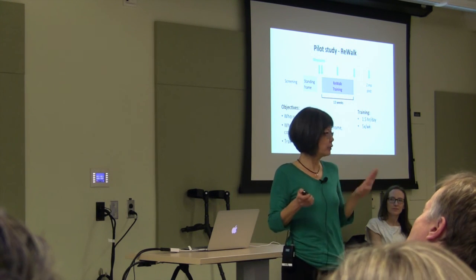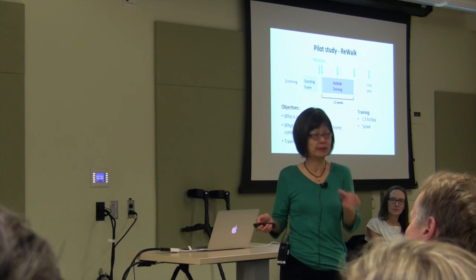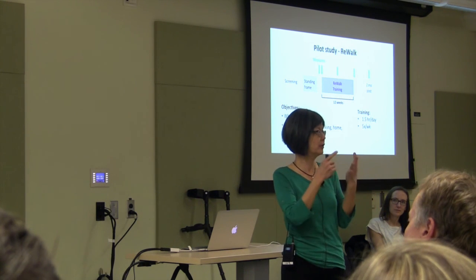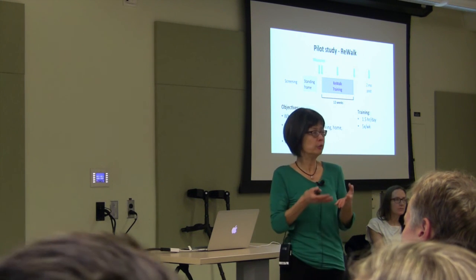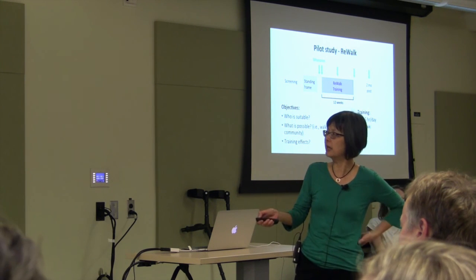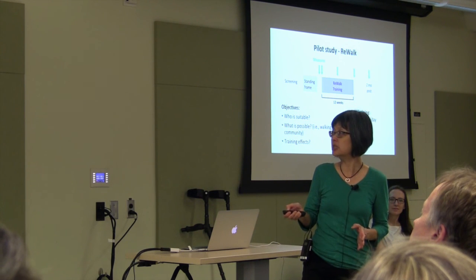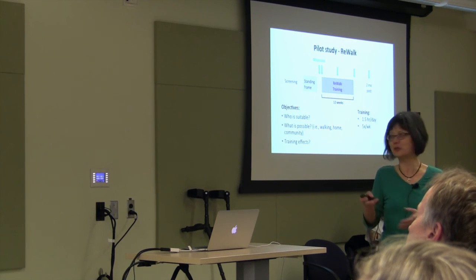The questions we're interested in right now are, who is suitable? What type of person is suitable? We know a little bit, but I think it's not very well known. What is possible in this device? Can you walk in the home? Can you actually do things in the home? What things can you do and not do? And can you walk with it in the community? And what are the problems? This is the type of study we're doing. And finally, because you're training for 12 weeks, that's a fairly long time and quite intensive, we want to know whether it's changing your nervous system. And if so, what is changing? Those are the kinds of questions I'm interested in.